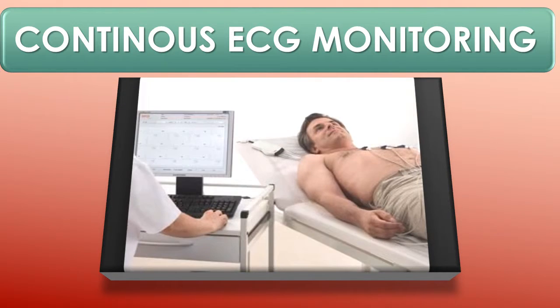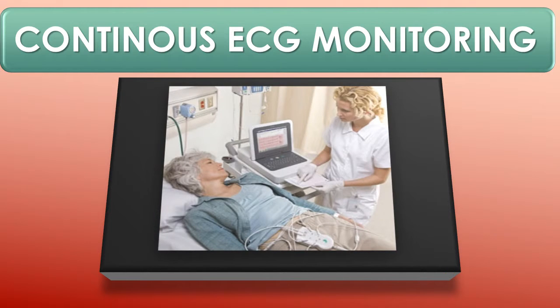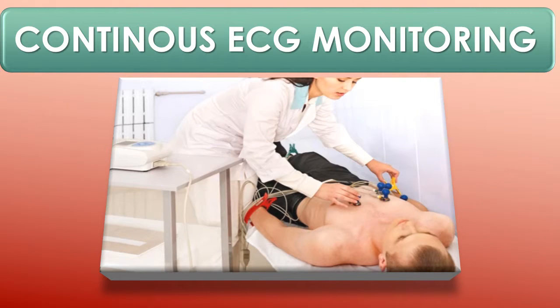As far as placing electrodes goes, the placing of electrodes can be delegated to an unlicensed assistive personnel who has been trained to place electrodes, but the actual monitoring of patient care is something that you cannot delegate. So remember that. You want to make sure that you're putting it on clean skin. You want to clip hairs or shave the area if needed. You want to make sure the skin is dry, free of lotion and tinctures, and is not irritated or scarred.